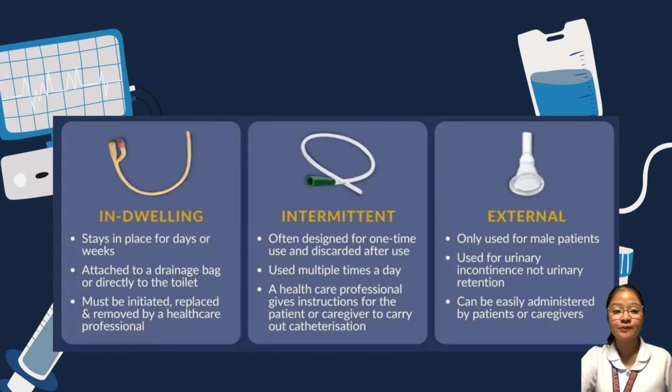There are three types of catheters. First is indwelling, next is intermittent, and lastly is the external. For this return demo, I'm going to use an indwelling catheter. Now, I'm going to state the materials.